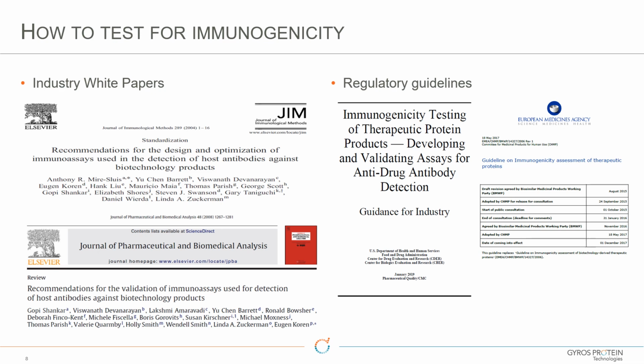Exactly. But one thing that's probably changed from the early paper is that the sensitivity requirements for clinical assays have actually got lower. So now the expectation is that you need to be able to measure 100 nanograms per mL of antibody in the presence of drug. So the assays have had to become more sensitive to deal with these changes in the regulations and the expectations.